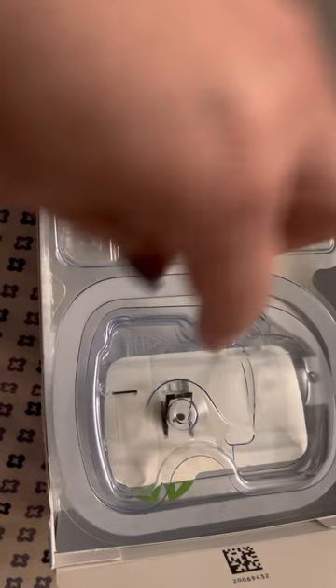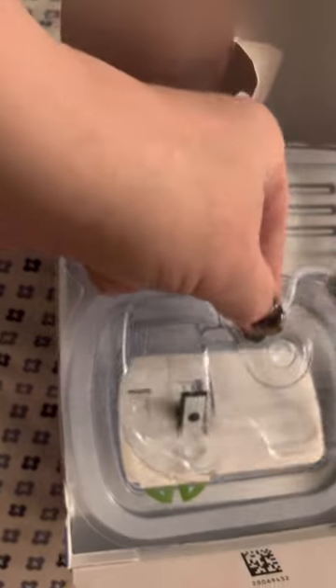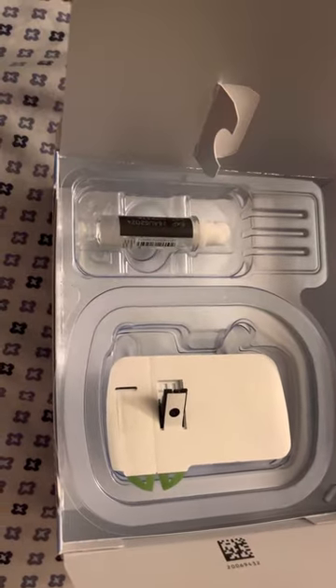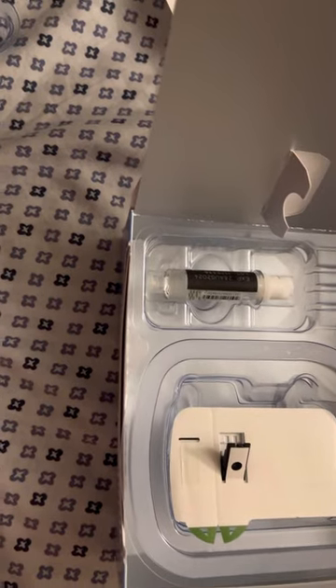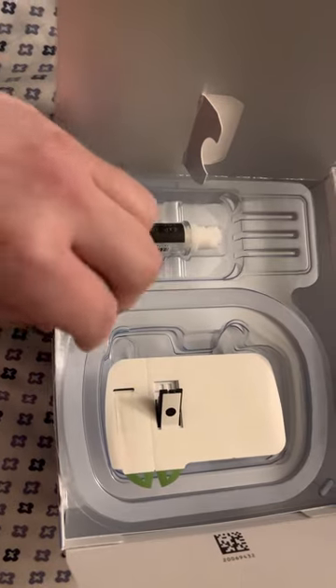Your package — I already opened mine — but you find this little tab here and you pull up. It might even be on this side, I don't remember. The device itself works better on your thigh, a nice flat, smooth area, and because it leaves a raised bump, you don't want it to be bumped.